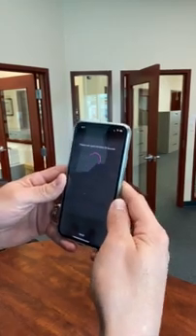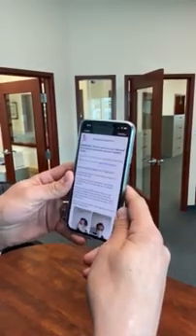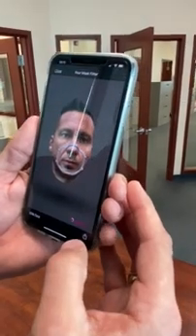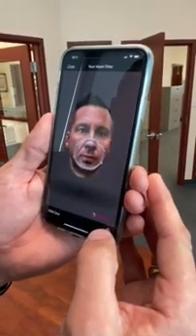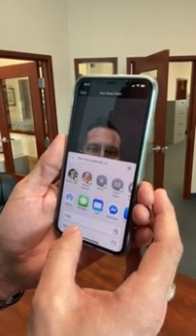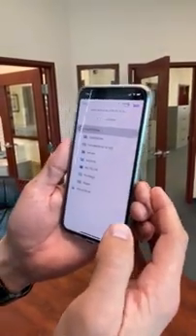Now you just wait for it to process, and what you're going to get is an actual rendering of what the frame is going to look like on your face. Then hit the bottom corner right button and save it to files. Now you've got an STL file saved on your phone.